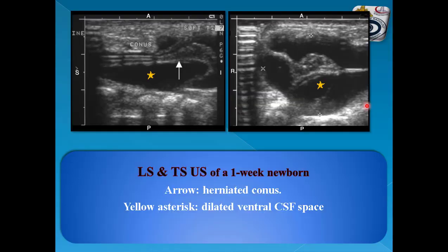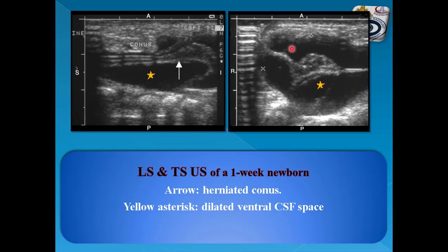Another example on LS and TS ultrasound of a one-week newborn: this is the herniated conus and this is the dilated ventral CSF space, also visible on the TS image.